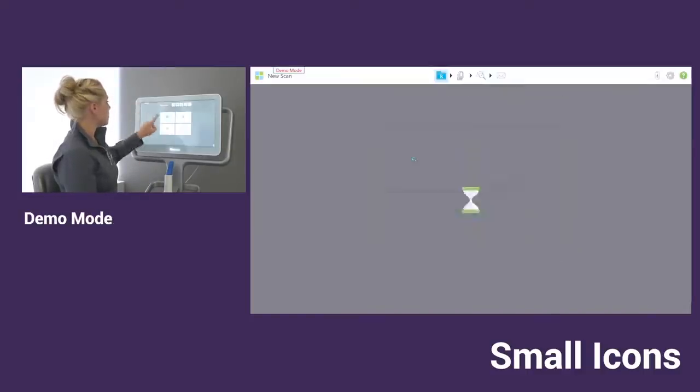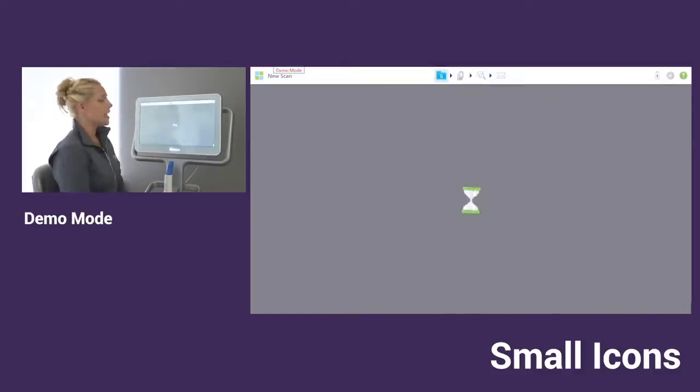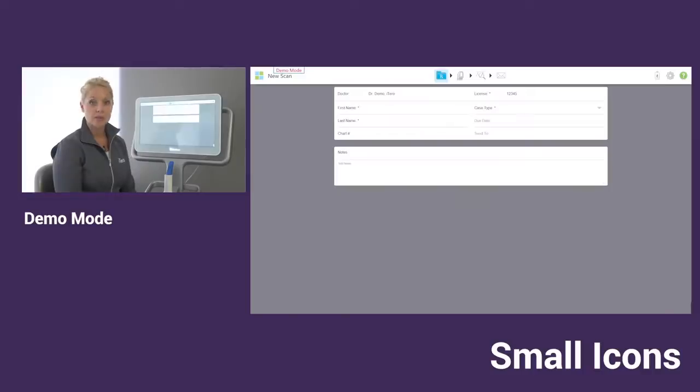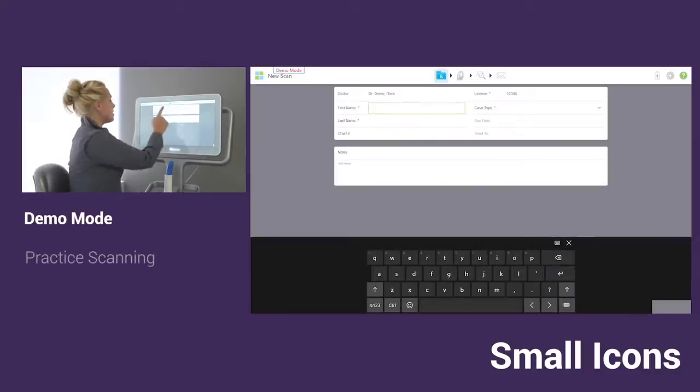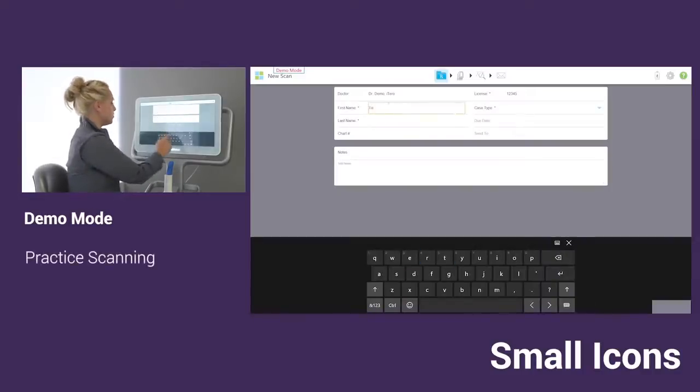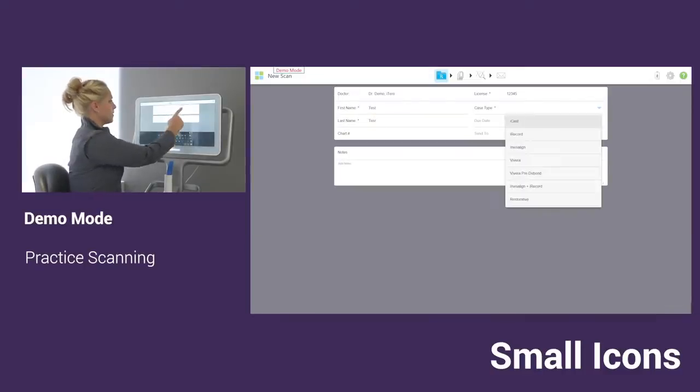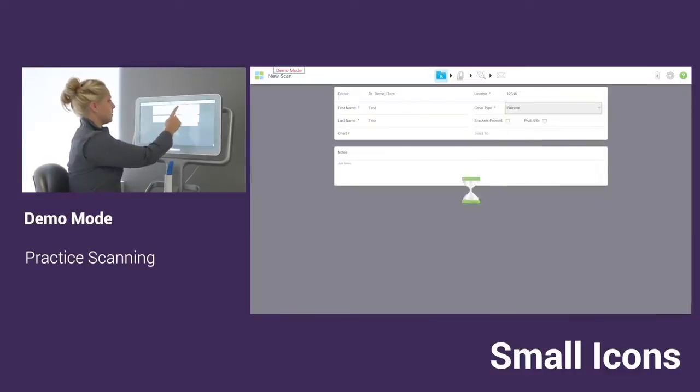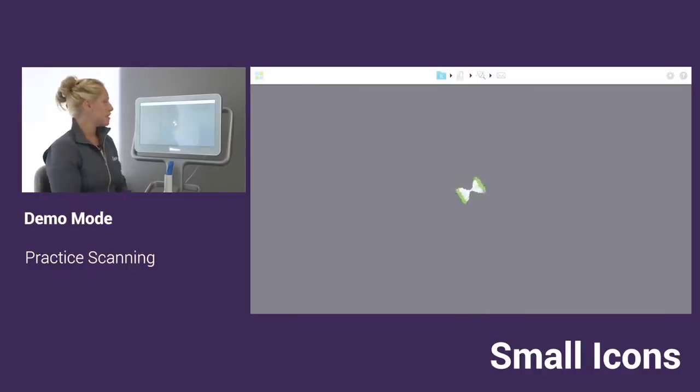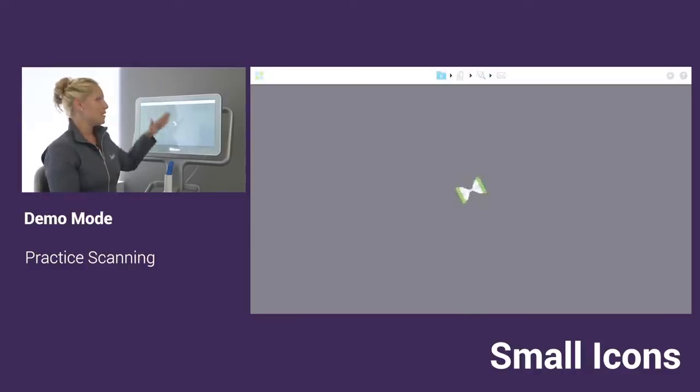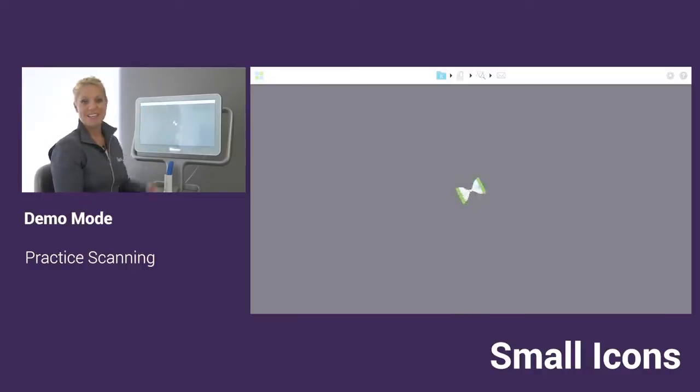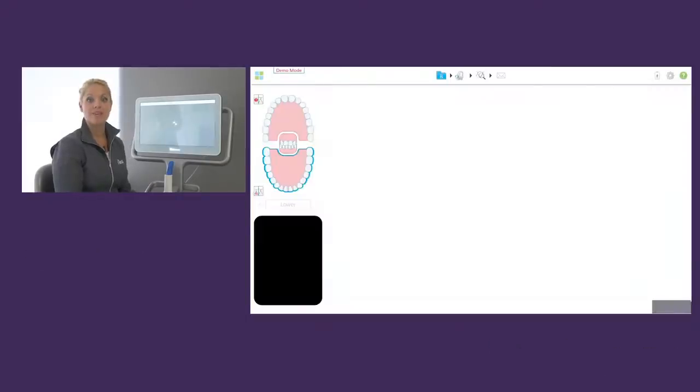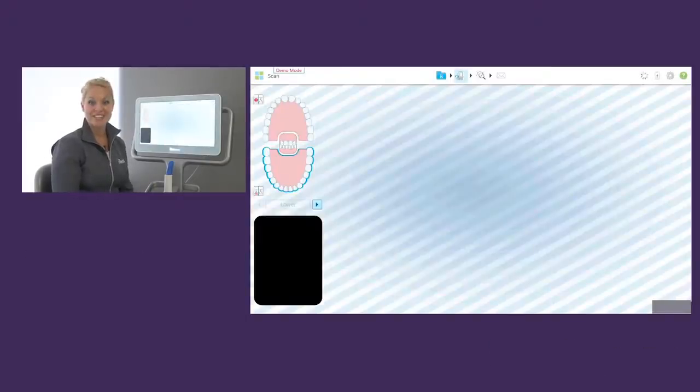You'll notice that when you go to practice scanning for demo, the screen will look a little bit different. When we are in the scanning screen for demo, you'll see that the background will be some stripes in the back, some blue and white stripes. So that will be your reminder that this case will not be able to be submitted.